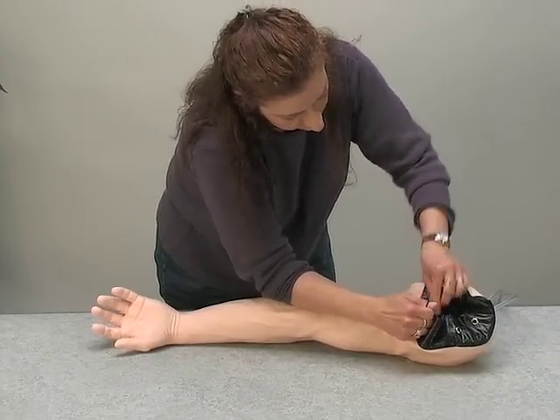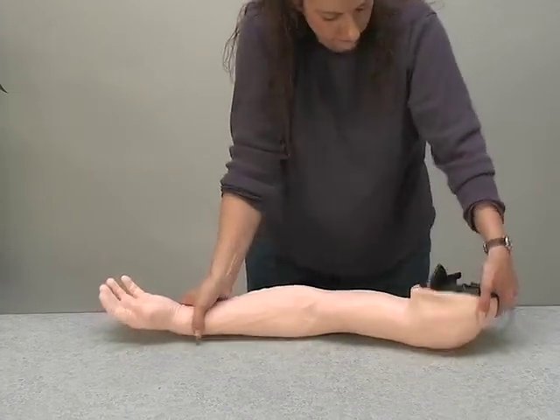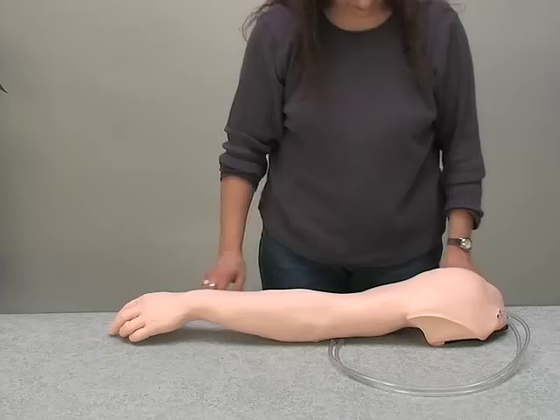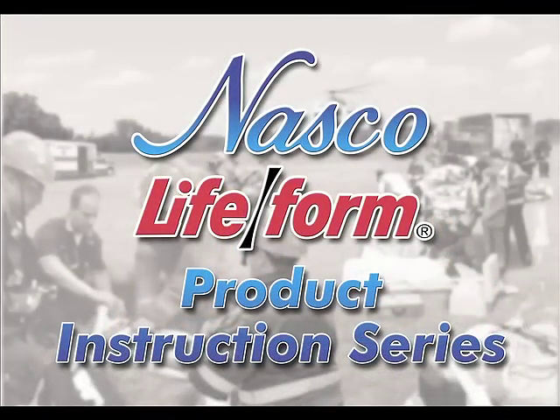Congratulations! You have replaced the skin and veins for the NASCO Lifeform Advanced Venipuncture and Injection Arm. If you have any additional questions, review the video, read the color-coded instruction manual, or contact your local NASCO distributor.